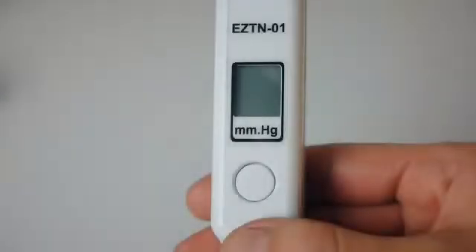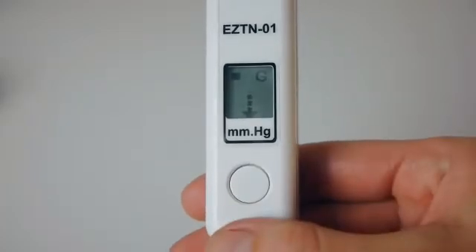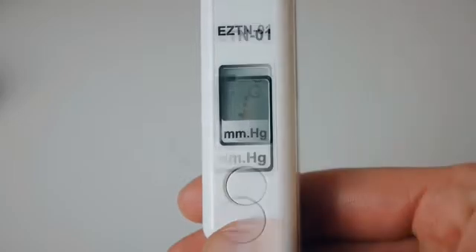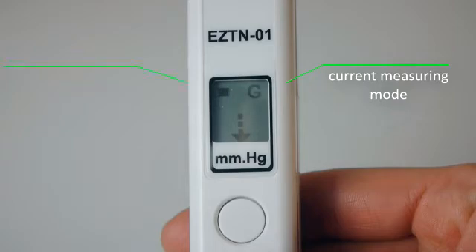How to activate the tonometer. Shortly press the on-off button to switch the tonometer on. When activated, the tonometer makes a beep and displays a moving arrow on its display, which is a signal of its readiness for measuring. The G or M symbol in the top right corner of the display stands for the current measuring mode. The indicator in the top left corner shows battery charge level.